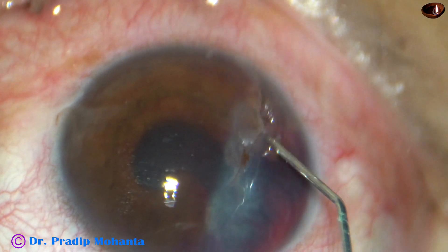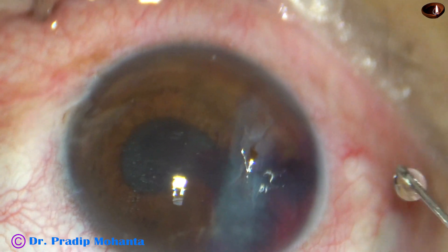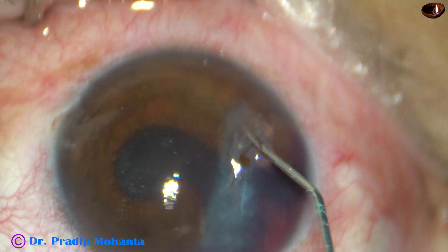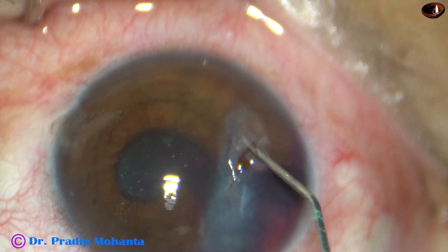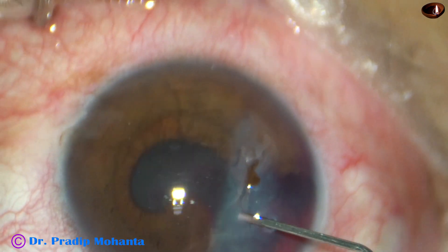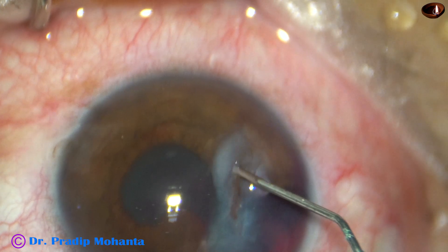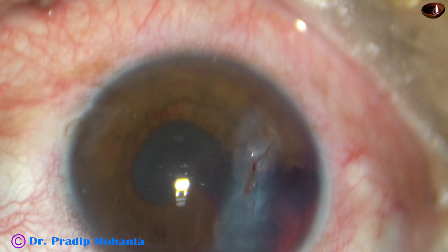And this is BSS. I am irrigating BSS through this wound for a nice lavage of the anterior chamber. And we can see the iris has again come to the wound.